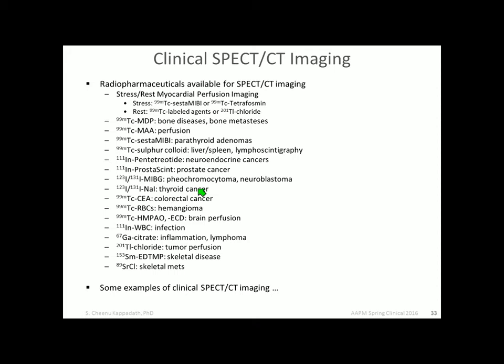So I'm going to now switch gears again, and look at a little bit of clinical imaging here, just to give you a flavor of what the clinical value of this is. I've listed a number of radionuclides that you can do SPECT CT on, and not all of these are investigational. Most of these are actually reimbursable here. SPECT has been around for a long time. So I'm going to show you some examples to show you the value of this.